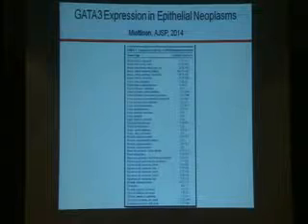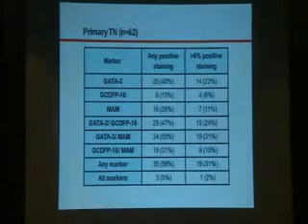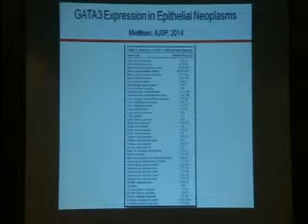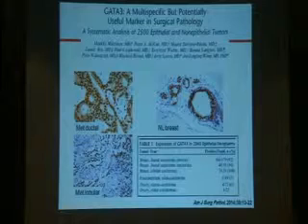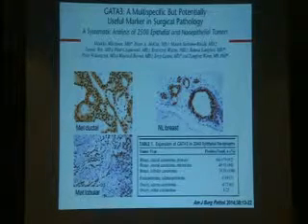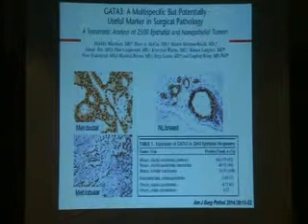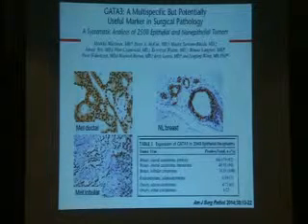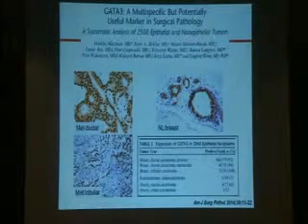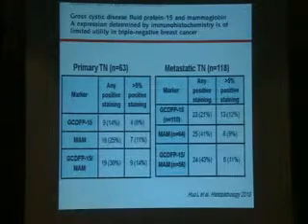And they did a very thorough evaluation of different types of tumors. Commonly, in addition to the common tumors like urogenital carcinomas, endometrial adenocarcinoma, ovary, and many other types of tumors can be GATA3 positive. So, and this is true for many other markers, any immunohistochemistry positivity should be evaluated in conjunction with histology features.